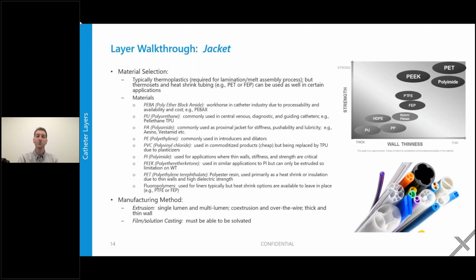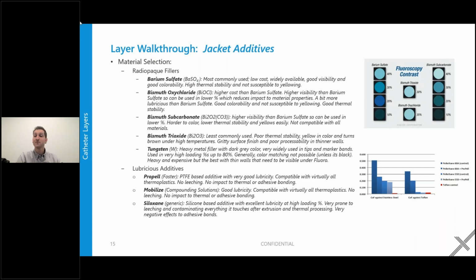And really, as far as multi-lumens, the sky's the limit. You see on the right here, we have this picture of the different kinds of multi-lumens. They can get really wild and complex. It's pretty cool. Now let's talk about some of the additives.